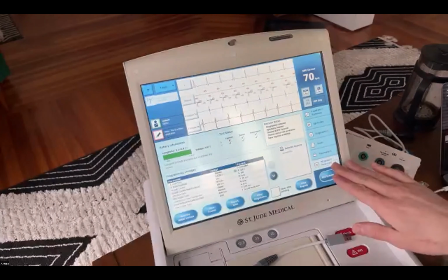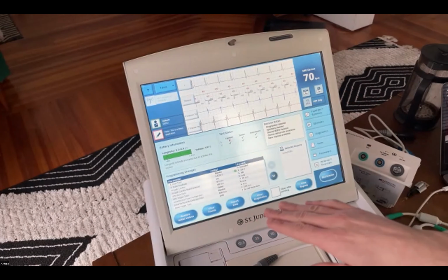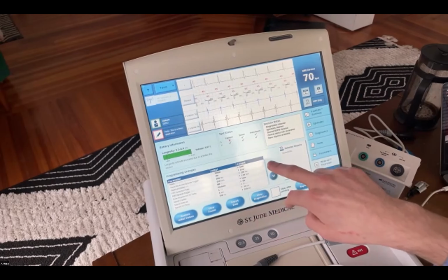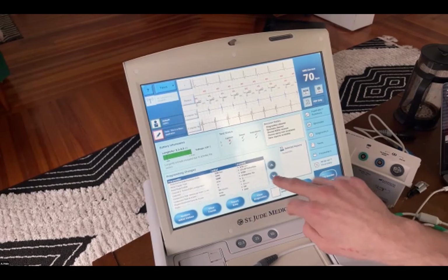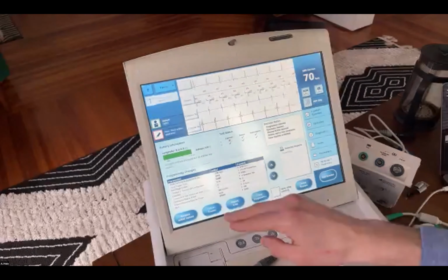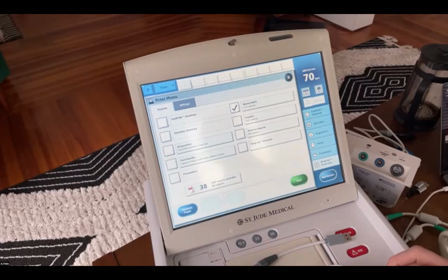Finally, the wrap up will be the final view of everything you've done, kind of gives you a summation, shows you all the changes you've made throughout the entire process. They are in alphabetical order, so they don't make sense if you look at the list. They're not like putting related programming together. It's all just alphabetical. Here's where you can select the reports you want to print.